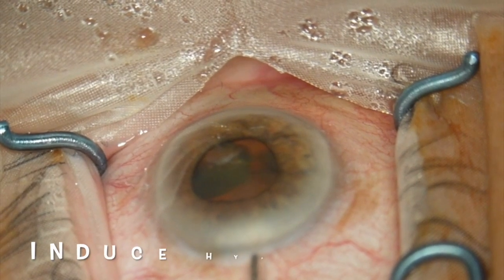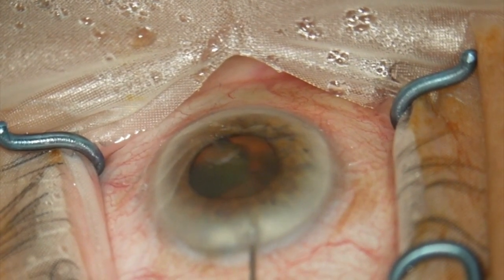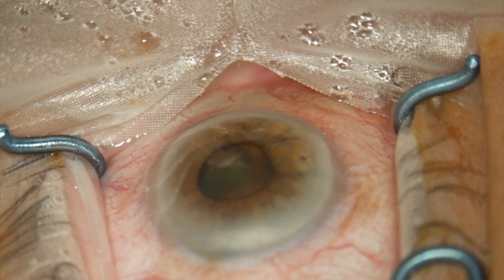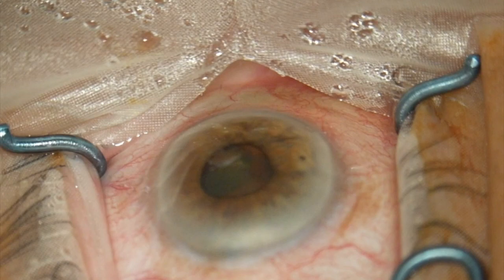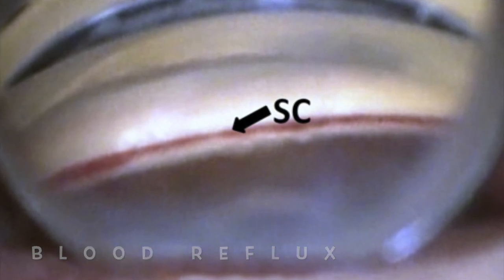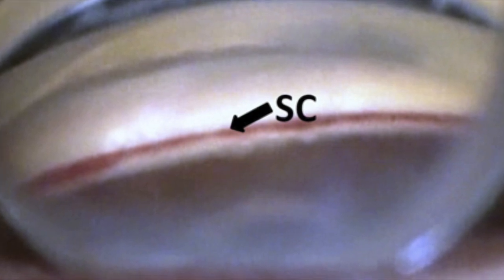Now, since the most important step of the surgery is identification of the trabecular meshwork, an important tip in this direction is to induce hypotony by burping the paracentesis incision so that you can visualize blood in the Schlemm's canal and be sure to be in the right plane, and not ablate the ciliary body and end up with devastating complications.